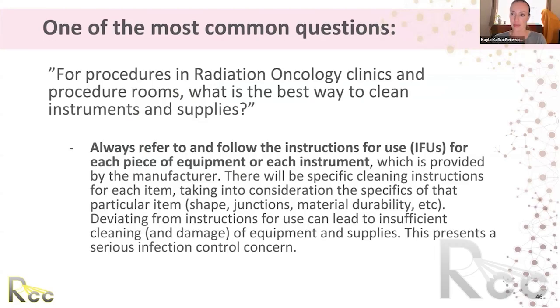If we don't clean it based on the manufacturer's recommendations, it can damage it, it can cause infections, it really can be very dangerous. There are times where what they recommend to clean it is not possible due to resources, depending on the region of the world. That's where you have to be very careful. But the guidance is always to follow the instructions for use, line by line, to ensure that we are following infection prevention and safety protocols.